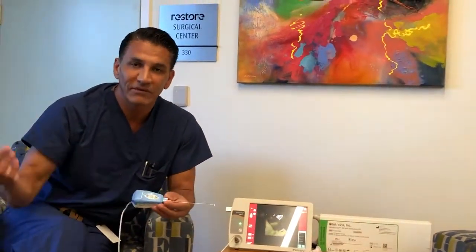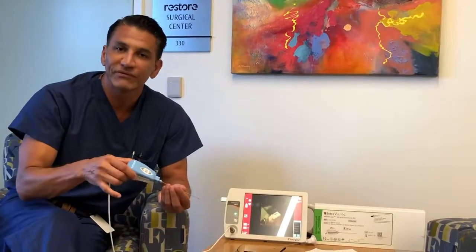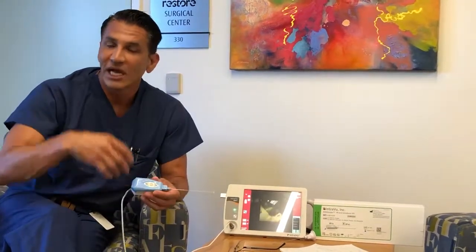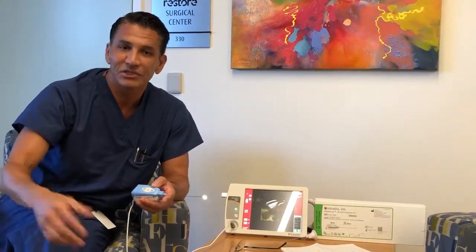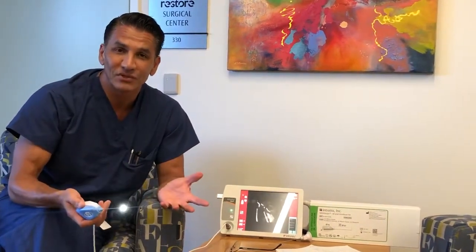4, hard to tell. The patient wants to have more information. They like to know what the post-operative recovery is going to be like. Needle arthroscopy, once again, procedure room, 30 cc's of lidocaine, you don't need any assistance. Put it in there, confirm what grade the lesion is, and then you can provide the patient the proper information so that when they schedule their surgery, they know how long they're going to be off for. I think that's actually very useful information for everybody, because then the surgeon can prepare for the surgery as well.